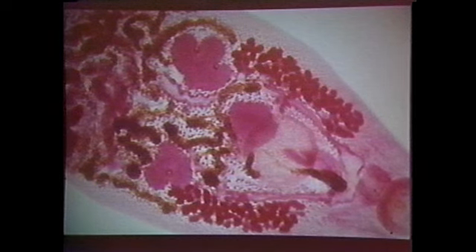Here's the anterior sucker and the ventral sucker, and he's holding on, and notice there's an intestine here. But look for eggs. Trematode eggs are described as being small and brownish. Here are two ceca, or two intestines, and the vitellaria on the periphery.